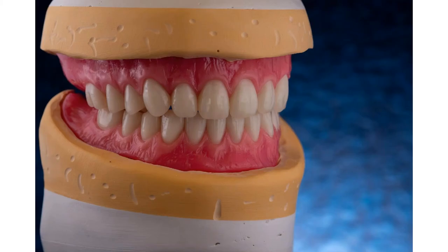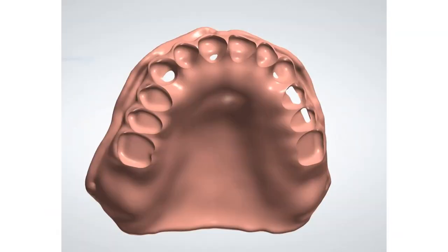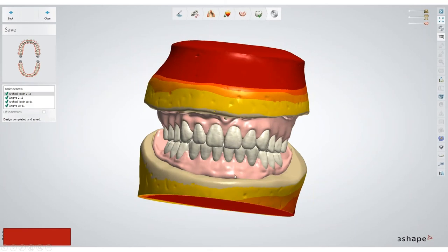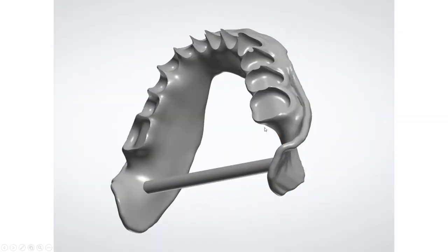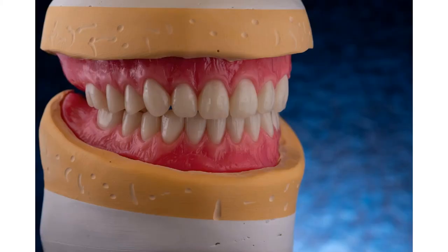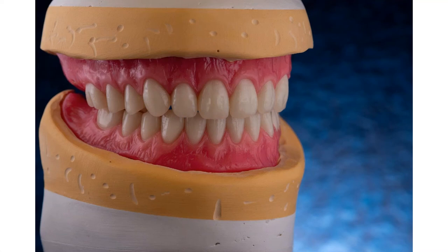Now the setup looks a little different — the base plates have some detail to them, but as you go forward the detail is done in wax. That's my own personal thing. I like to add a little detail, and adding texture with wax on the facials actually helps quite a bit when going through the boil-out technique. If you have a base plate sitting in stone, having a small layer of wax in the front will help to divest things a little bit better. For her, we did a try-in. As you can see, we corrected the cant and closed up those buccal corridors, eliminating those big dark triangle areas. Her bite was really nice and stable.